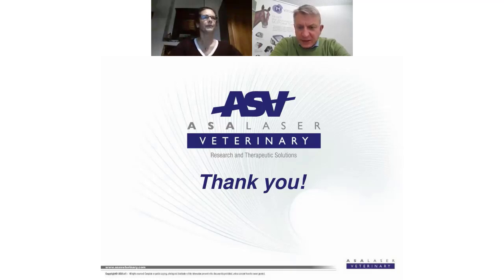Okay. Another question, from Marie. For insertion of the suspensory ligament, for example, the 3 programs that are done on the same day, which time for each program? Edema, acute tendinitis, bone injury? Okay, I treat only 1 time a day, and I can put more protocols one after the other. I don't do 1 protocol in the morning and 1 in the evening, not at all. I do the protocols one after the other.